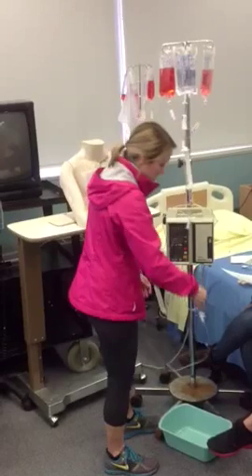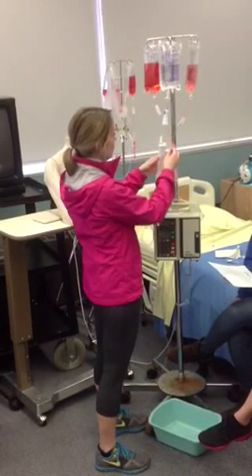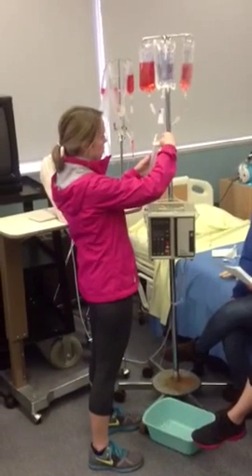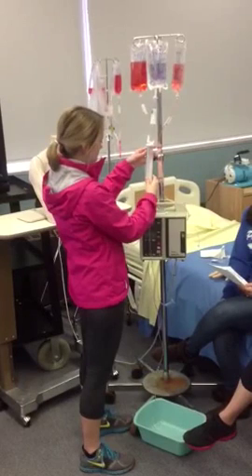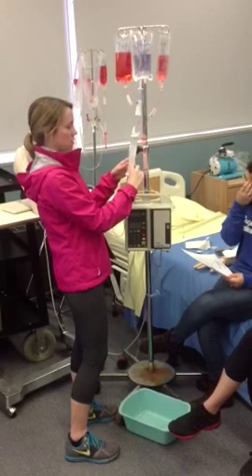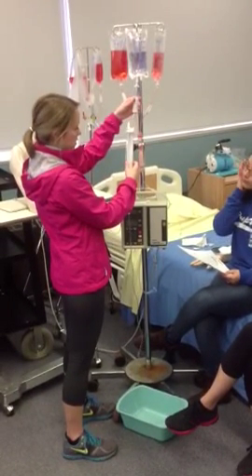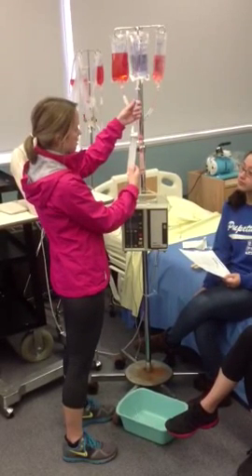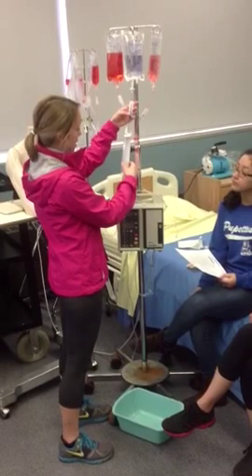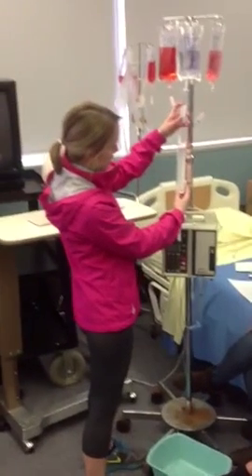We're going to flush it first. We'll open this little cap right here at the top of the Buretrol, and we're going to fill this chamber — which is basically like a buffer — so the patient doesn't get too much fluid. We're going to fill this with about 30 milliliters, so we unclamp the top one and let 30 milliliters flow into the container.